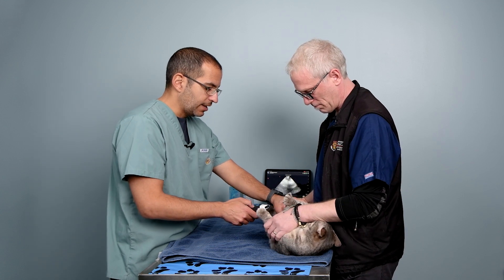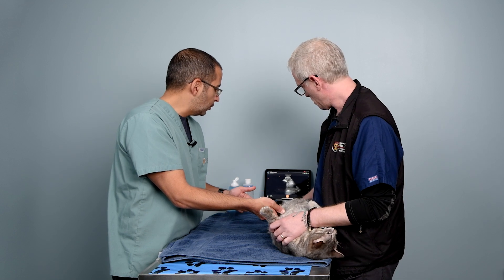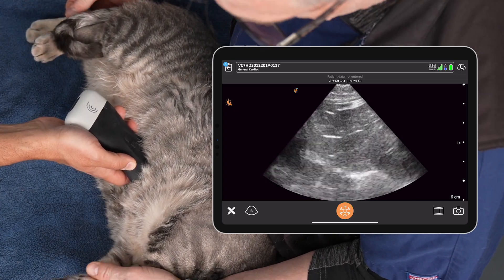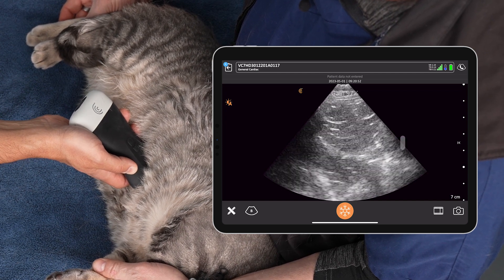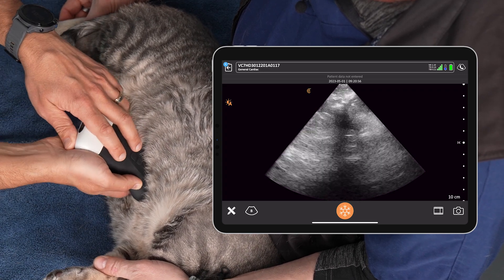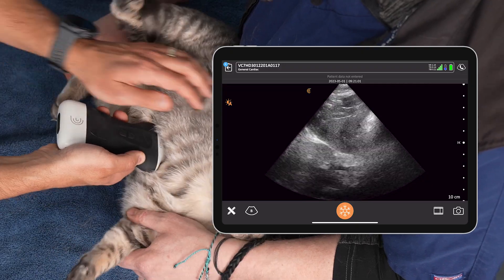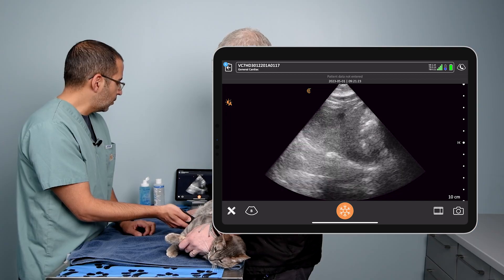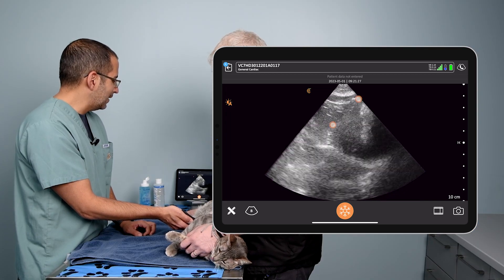Alright, so here we go. I'm in the sub-xiphoid and Daisy seems to be more comfortable in this position. Alright, marker is cranial. We start seeing the liver there. I'm going to adjust my depth so that I can see the entire liver within my window. That's going to be very important — you want to see the liver, the diaphragm, and then the region beyond the diaphragm into the thoracic cavity. So, probe is in the sub-xiphoid region and we can see the diaphragm and the liver there.